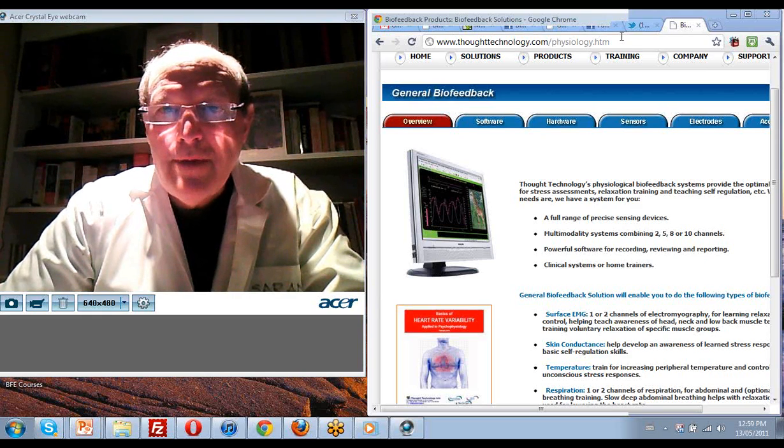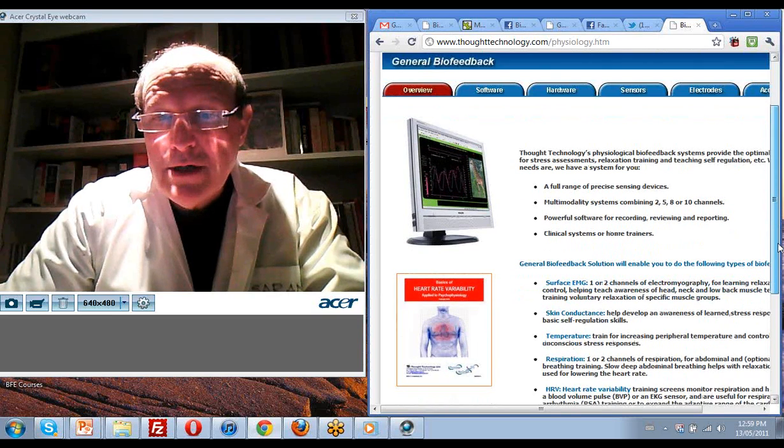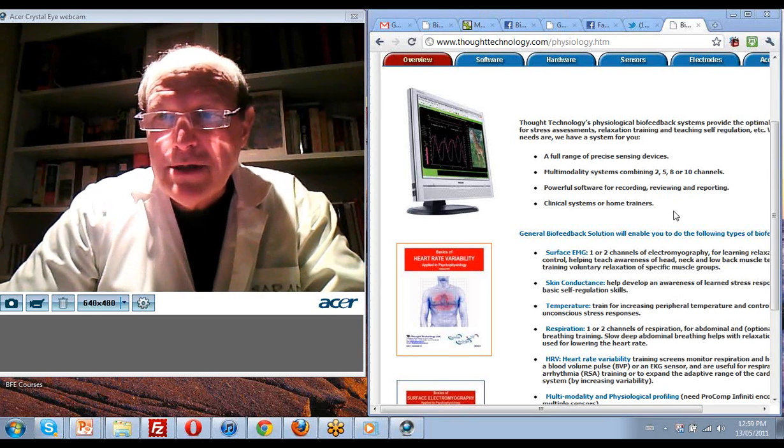For those who are not familiar with the Thought Technology website, I recommend you go and visit it at www.thoughttechnology.com and take a look at the general biofeedback solutions, where you're going to find a solution to many problems in today's health world and sports, which is solved by heart rate variability training, which is what we're going to be looking at today with a respiration sensor and a blood volume pulse sensor. Let me just show you, as John Bale demonstrates for us, the ease with which it is to get started with the Quick Start to Infinity.